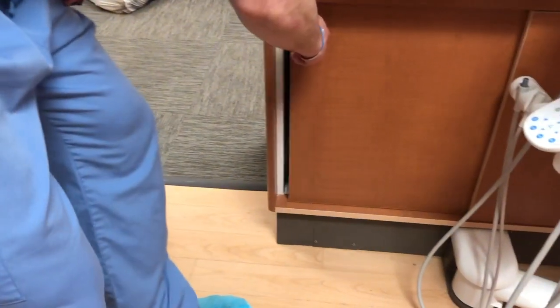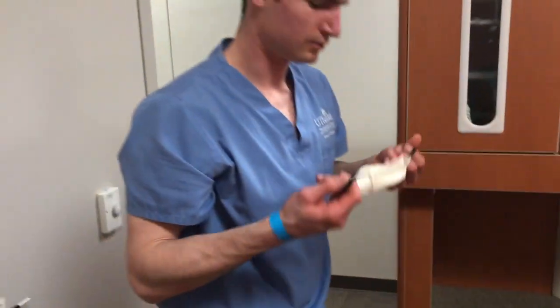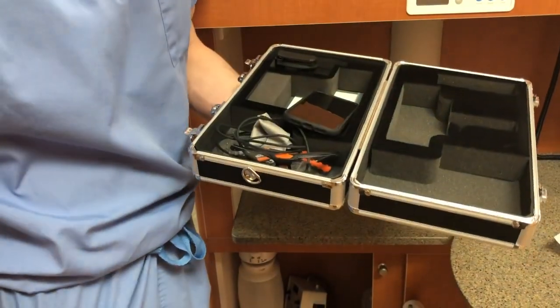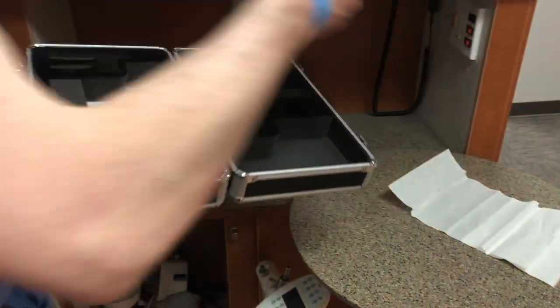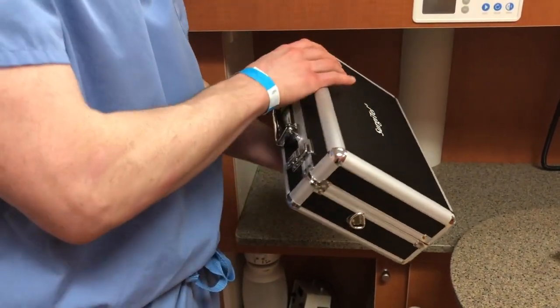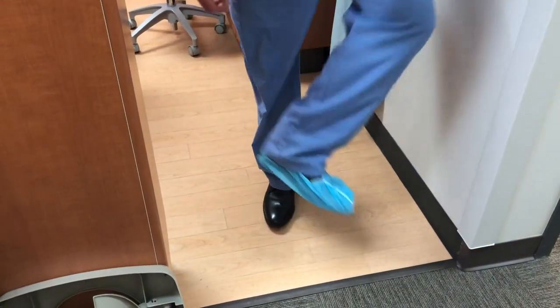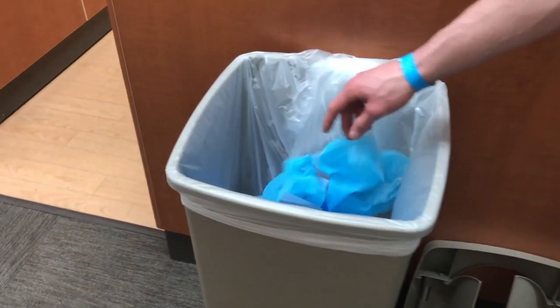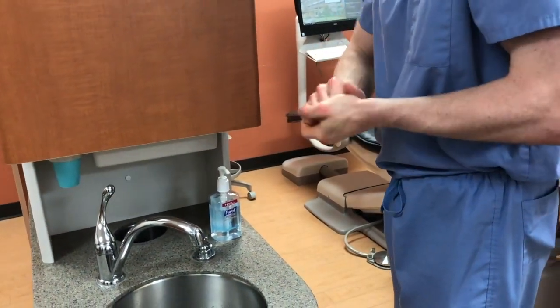You can now retrieve your belongings from the cabinet, including your daily mask, which you should put on. Remove your shoe covers and perform hand hygiene one more time before you leave the clinical area.